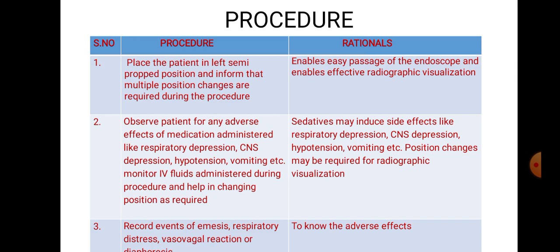Observe the patient for any adverse effects of medication administered like respiratory depression, CNS depression, hypotension, vomiting, etc. And monitor IV fluids administered during the procedure and help in changing position as required. It will help, as sedatives may induce side effects like respiratory depression, CNS depression, hypotension, vomiting, etc. Position changes may be required for radiographic visualization.